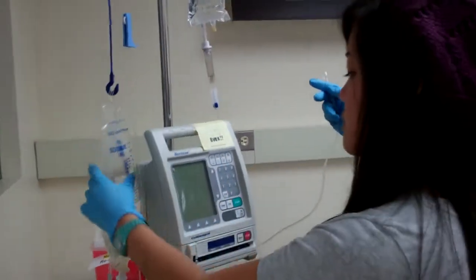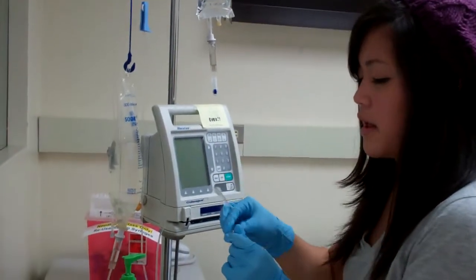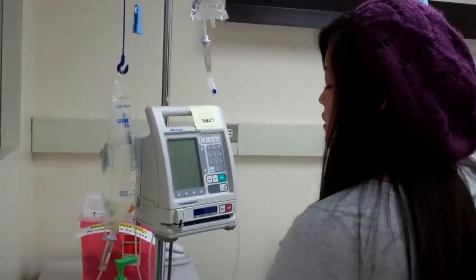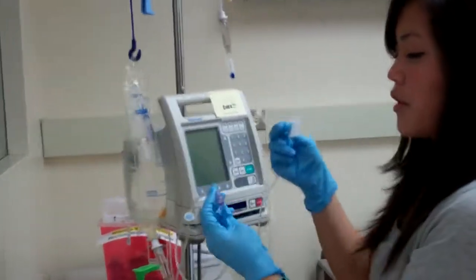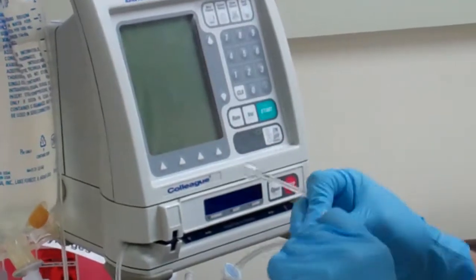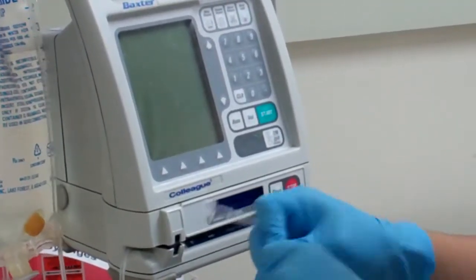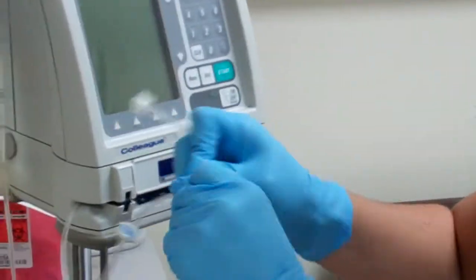And then I would connect my piggyback to the correct port, which is the port below the primary bag line. I would also disinfect this for 15 to 20 seconds.